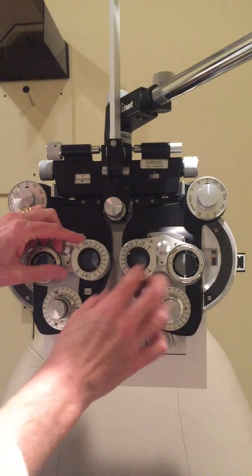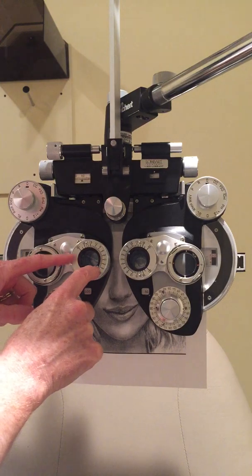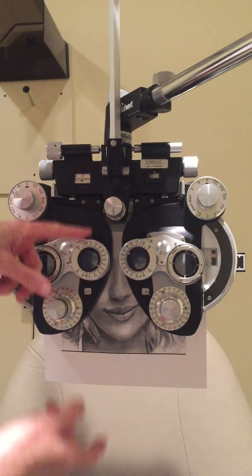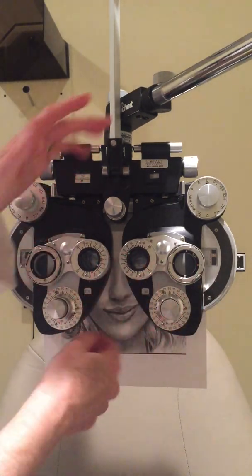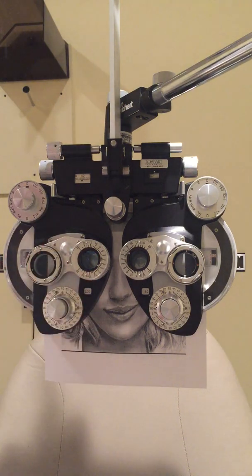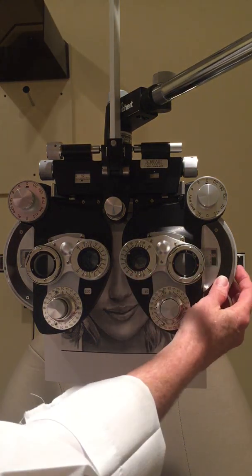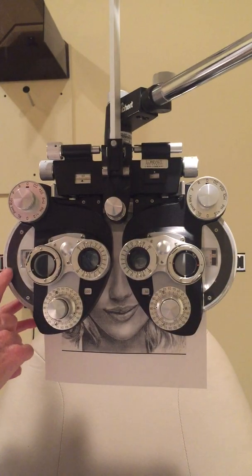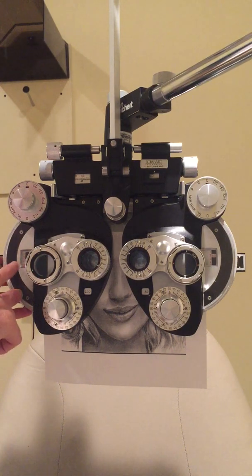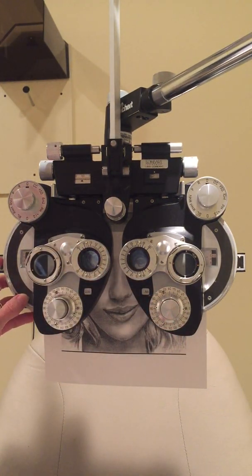I put in Risley prism — six base down for the right eye so her image appears higher, and six base up for the left eye so that image appears lower. I ask her to look back and forth between the two blurry images. She confirms she sees double. She reports the bottom image is sharper, which is the left eye, so I leave it alone and add minus to the right eye to blur it up. After two clicks of minus, she says the top is now sharper — exactly what I expected — confirming consistency.